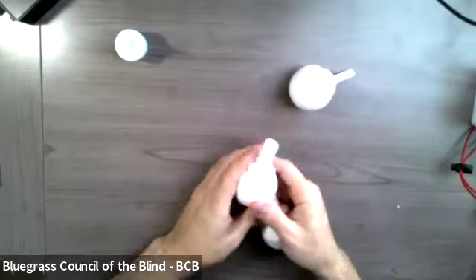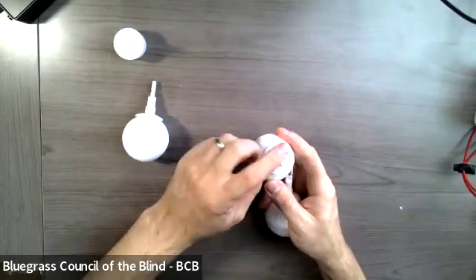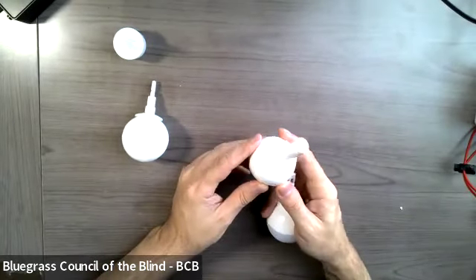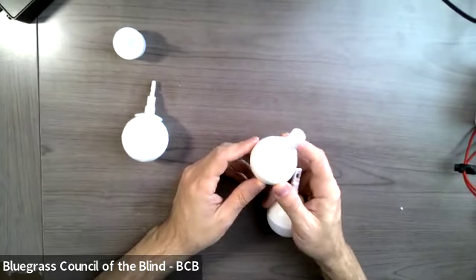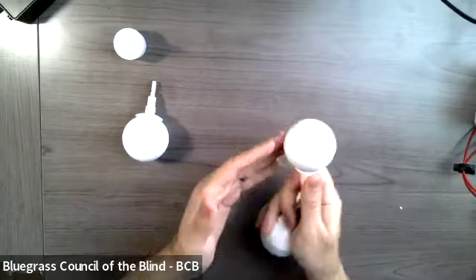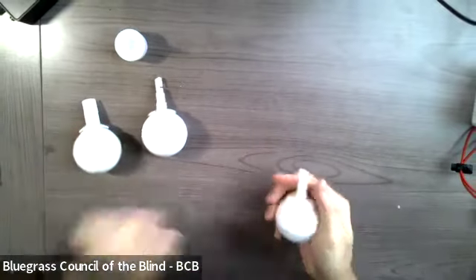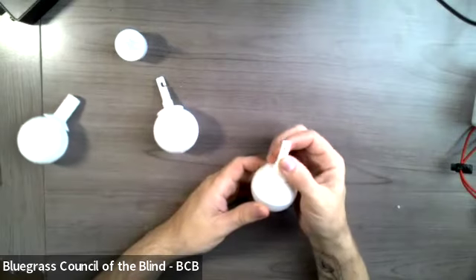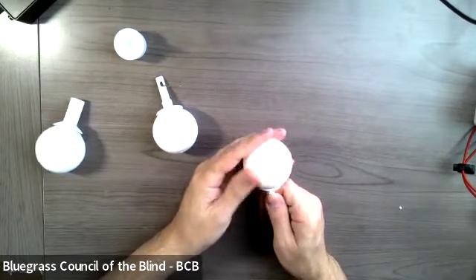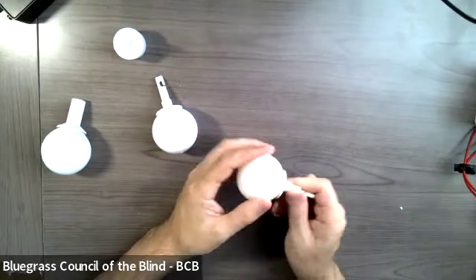I also have a slip-on here. So the slip-on just does what it says. It just slips right onto the end of the cane and sticks on there through friction, just kind of wedges itself on there. But this is also a rolling slip-on ball tip. And this particular model is a hook version, but this is that high mileage rolling ball tip also. So this one will last a little bit longer than the other one.